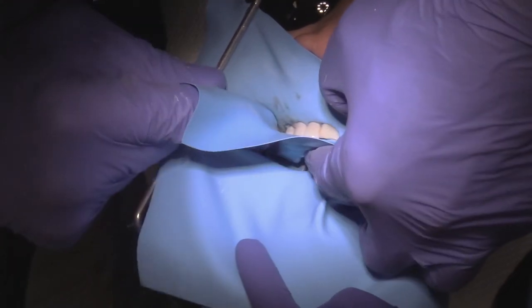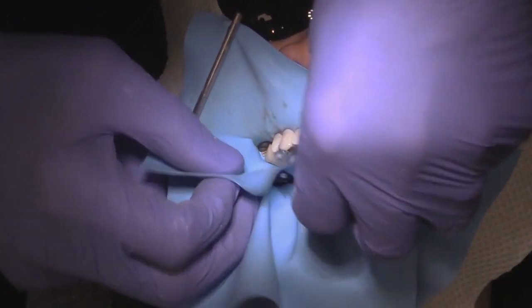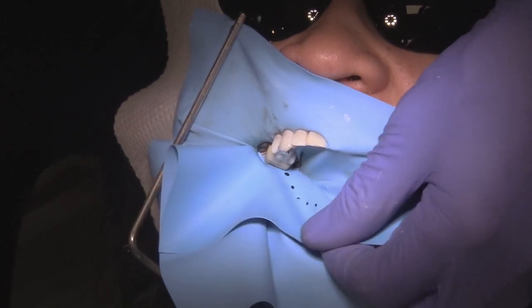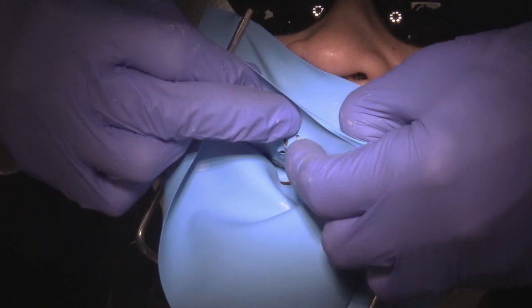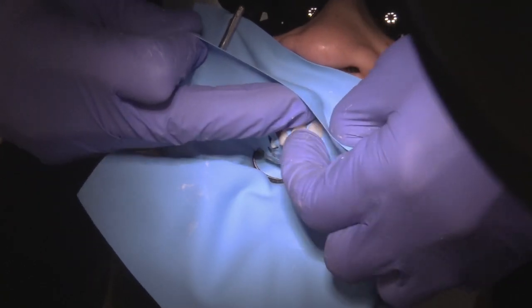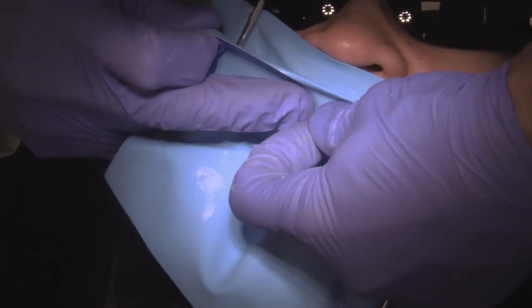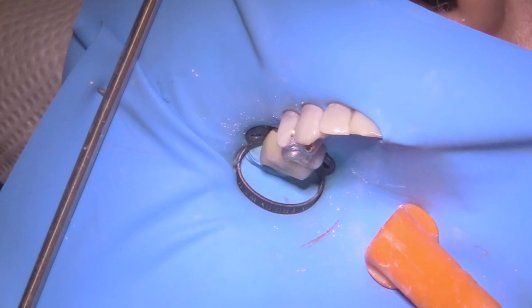When performing a procedure where we're going to photograph things, I like to place a second rubber dam on top of the initial one — this is the double dam technique. It's simple: just place another dam on top of the one already in position. This is also a great solution when your rubber dam has torn during a procedure and you must maintain a dry field, such as during a bonded ceramic cementation or a composite procedure. Rather than removing the whole dam, simply place a new one on top.